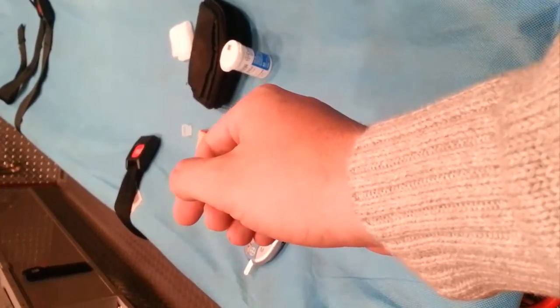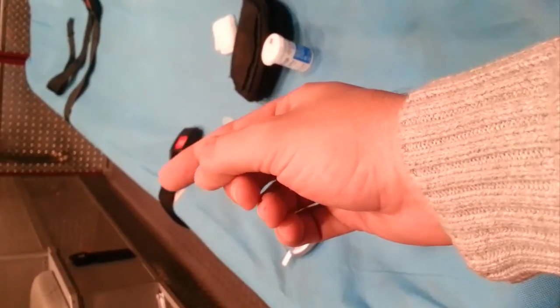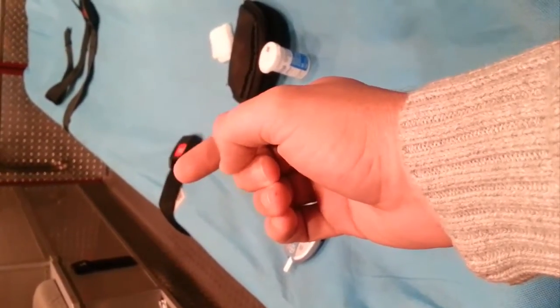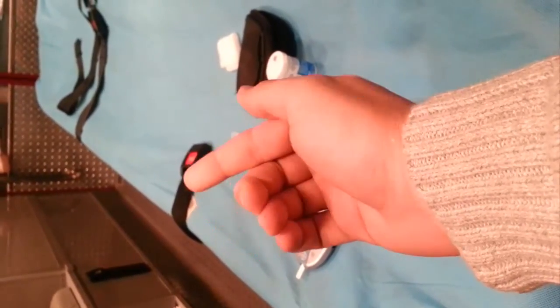So when you come to make a finger stick, I know it's very tempting to use the index finger. It's out here in the open. There's nothing really blocking you from getting to it. It's an easy stick. But the problem is you use it all the time. Touch pads, pens, pencils. A lot of pressure on here. A lot of use.